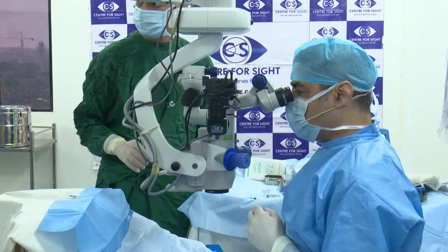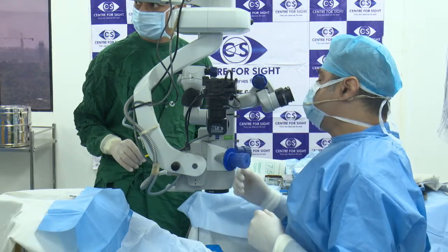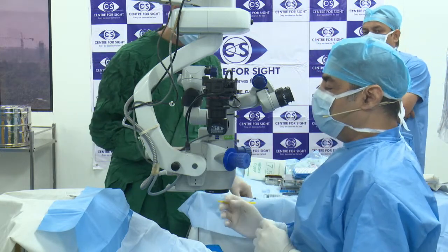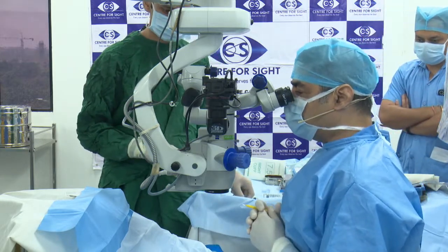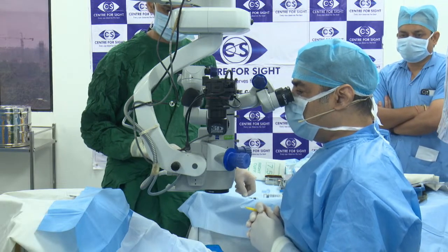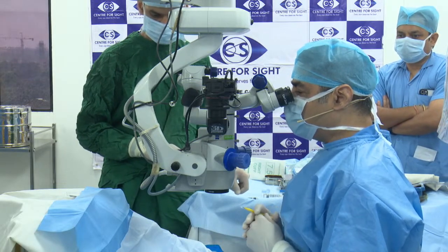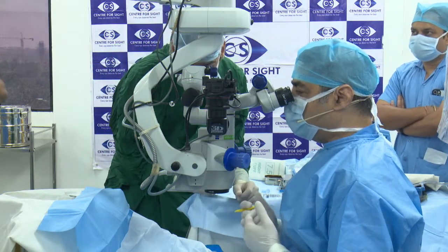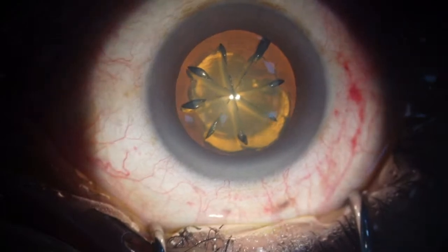Hello, am I audible? Yes, sir. Okay, so I have this patient. I demonstrated the femto for this. You can actually see in retro illumination that there are pneumo bubbles which have slightly dissected the lens as well. So I will not be able to do a good hydrodissection. I will just use very little fluid.